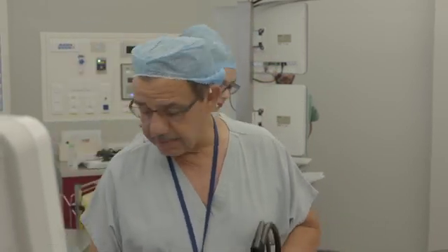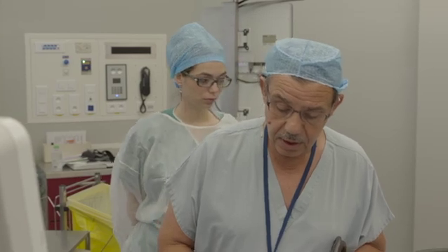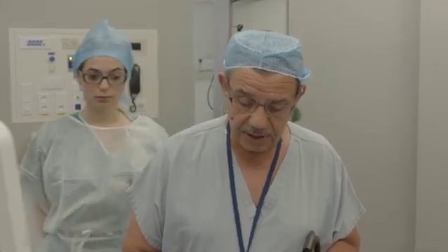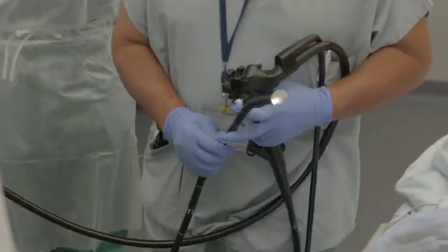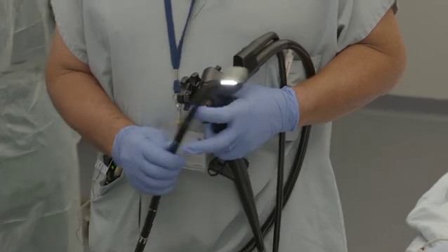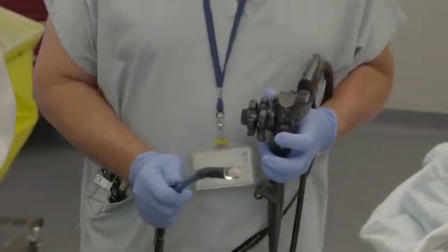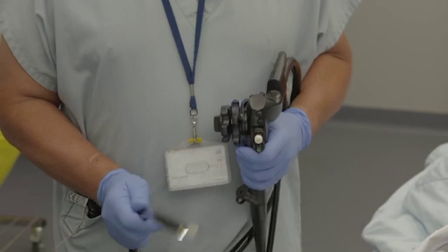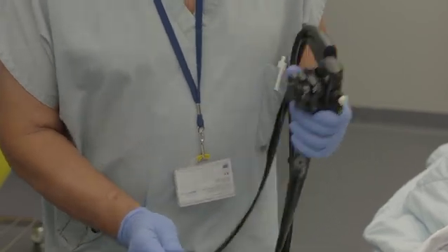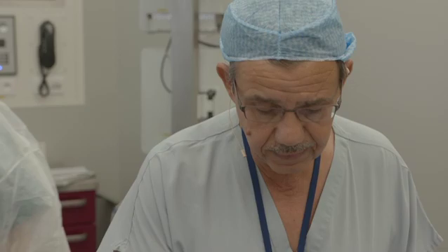For this examination, I use the therapeutic scope from Pentax, and I will also use the new needle from Cook — the new 20 gauge needle.